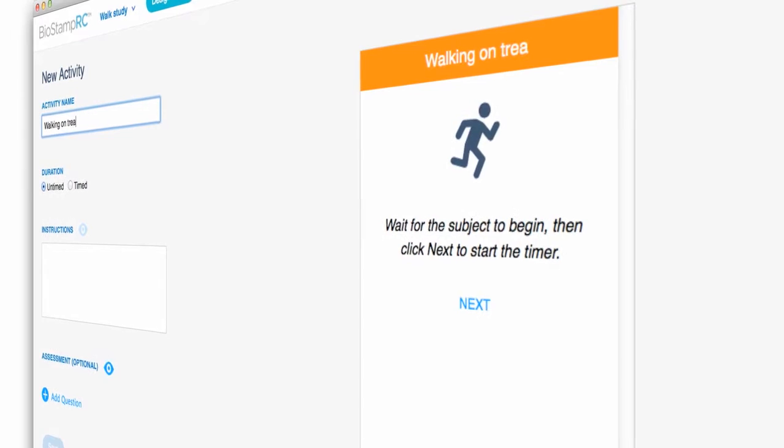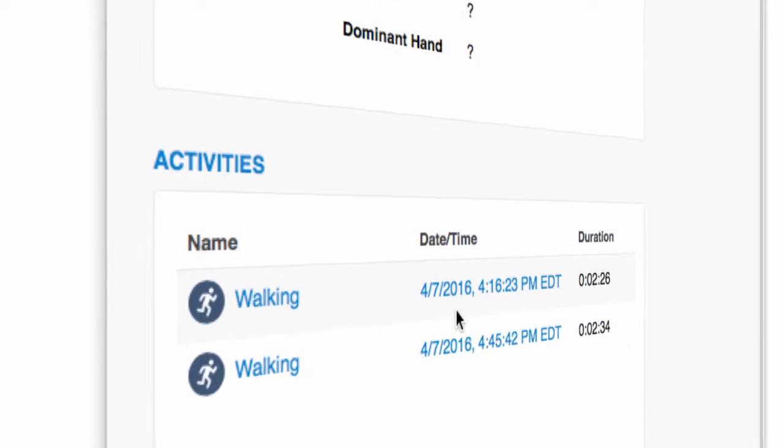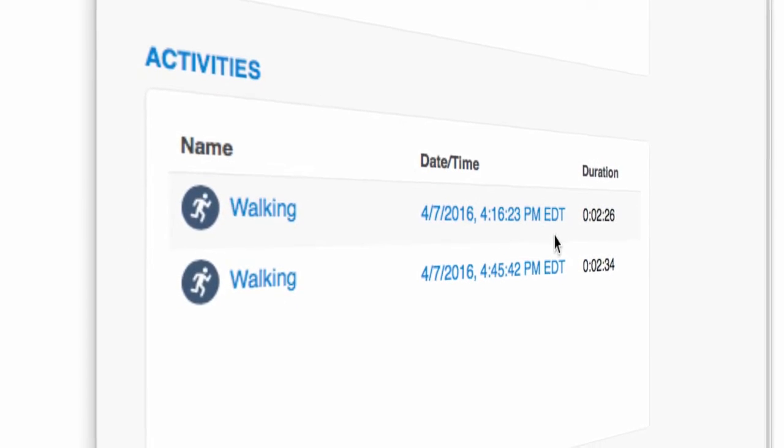Activities and Diaries, defined in the Investigator Portal, contextualize subject information by timestamping the beginning and ending of windows within the recording session.